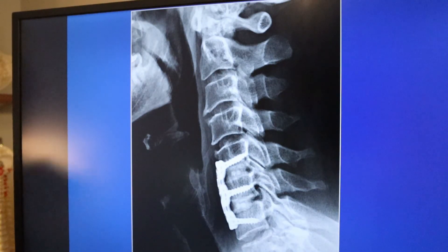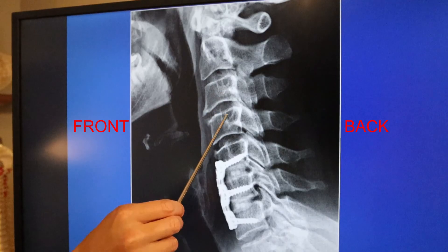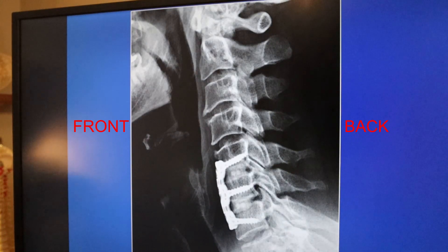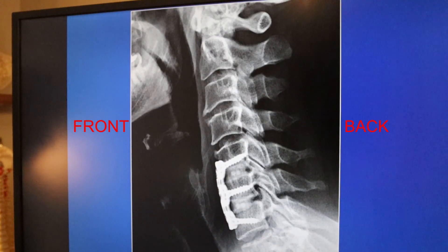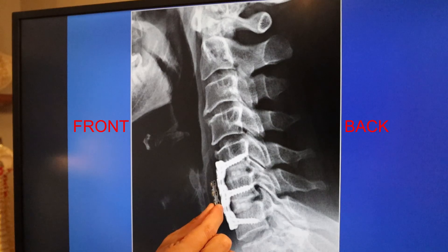When we put in the bone graft, plates, and screws, we use our experience, x-ray guidance, and neurological monitoring. Despite our best efforts, if there's a problem with the plate or screws we'd have to revise them, but it is exceedingly unusual to have to go back to revise anterior cervical hardware — less than one in a thousand. Here's a patient who had a two-level anterior cervical fusion at C5-6 and C6-7. You can see the bone placed to keep those disc spaces open and aid fusion, along with the plate and screws in the side view.